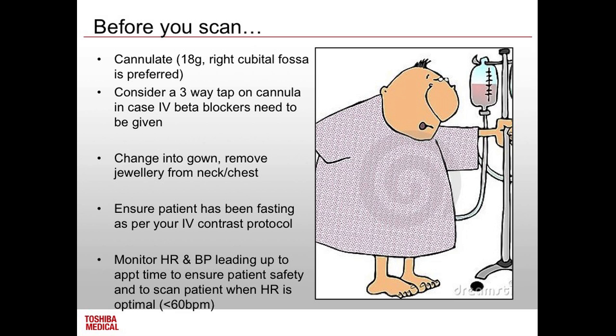You could consider putting in a 3-way tap in case you use IV beta blockers. We've gone from using oral metoprolol, the name of the beta blocker we generally use, to giving IV beta blockers. I think the jury's out on that a little bit. I personally, this is only personal, am a fan of oral beta blocking. I think it lasts longer.